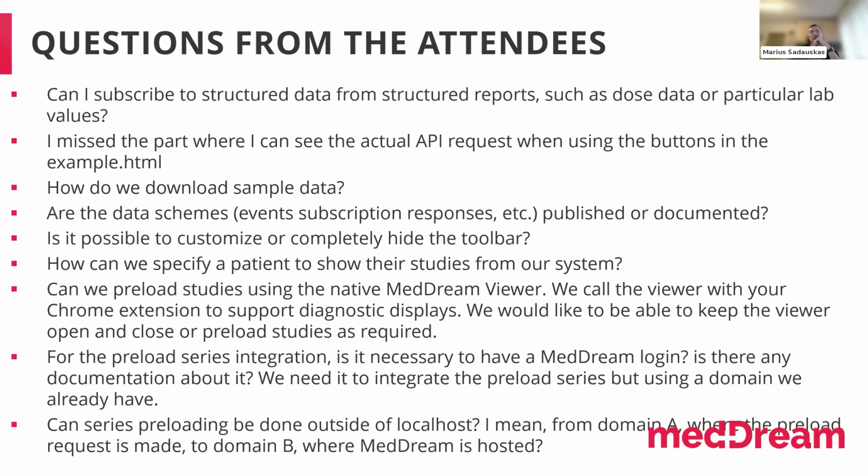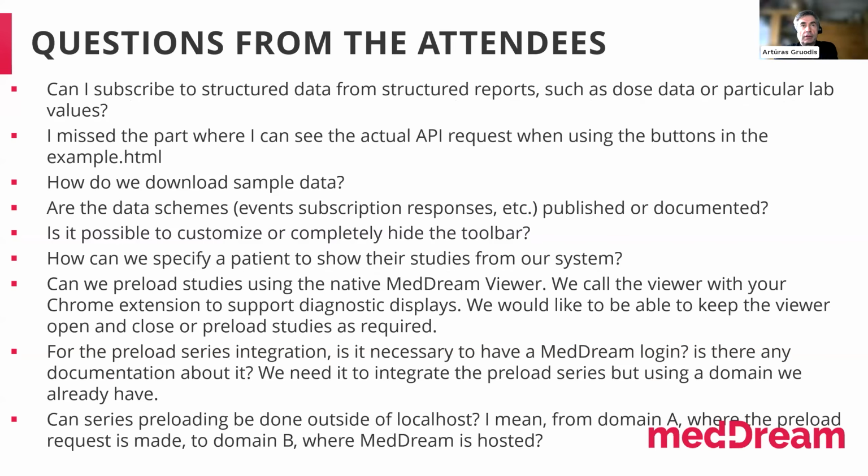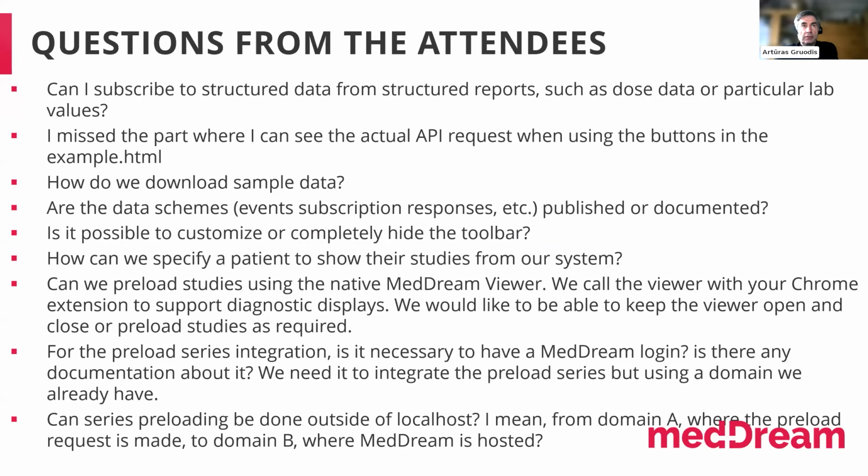For the hiding, I don't think that we have an option to hide completely. We don't have an option to hide at all, but in the mobile version right now we implemented the possibility to hide some buttons, and when you press on the three dots, then we show additional ones. So in principle, you can leave only three toolbar options, and the fourth will be the button with three dots. When you press it, then you will see more buttons if needed.